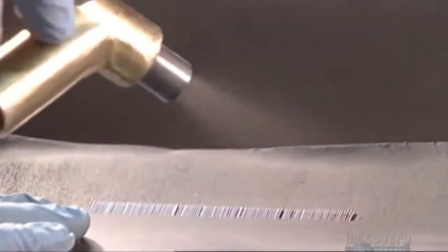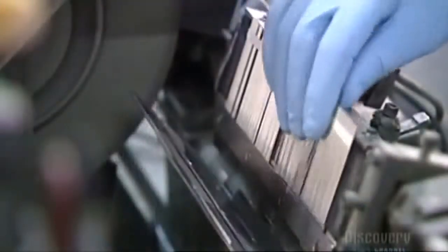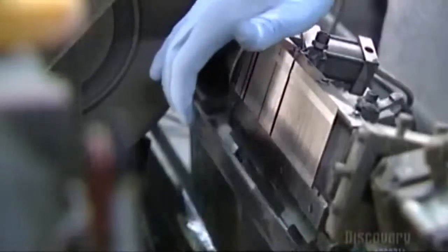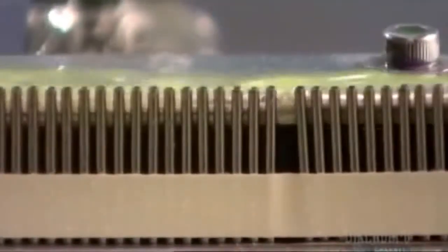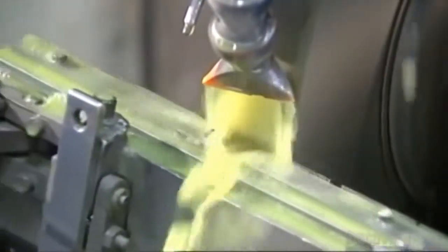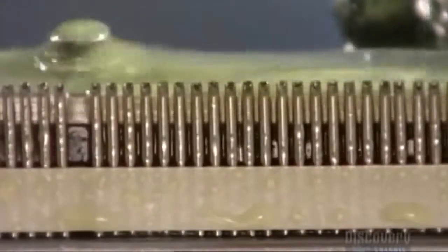They spray aluminum oxide on the ends of the tubes to rough them up so that the surface will be easier to work with. Now they place the strips of tubes into the grinding fixture and snap it shut. Coolant flushes over the tube tips as the fixture moves across a grinding wheel. The wheel grinds through the tops of the tubes, shaping them into a rough point. This is only the first grind, so it's not yet needle sharp.